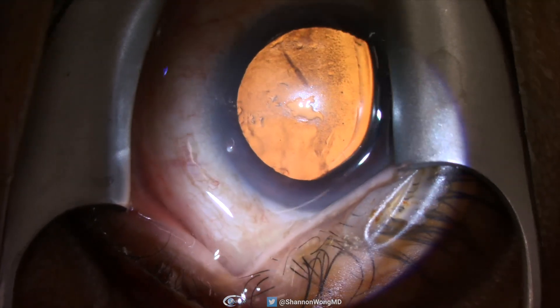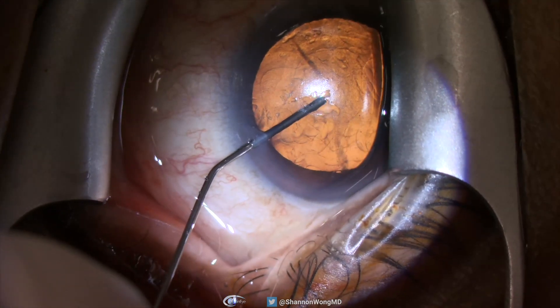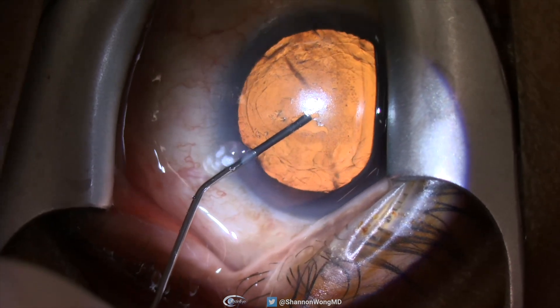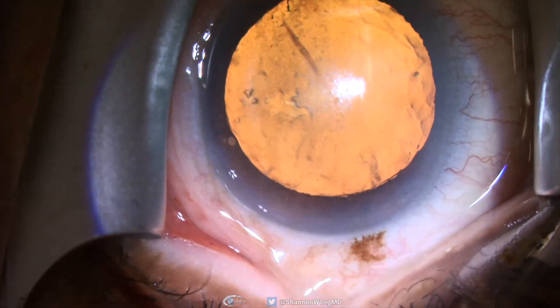My technique involves placement of intraocular lidocaine and viscoelastic through a side port incision. Then a second side port incision is created to place the Hydrus stent. The stent is placed before starting cataract surgery.